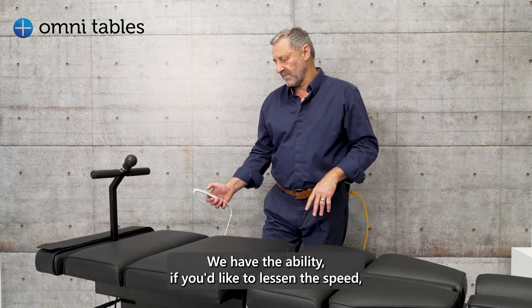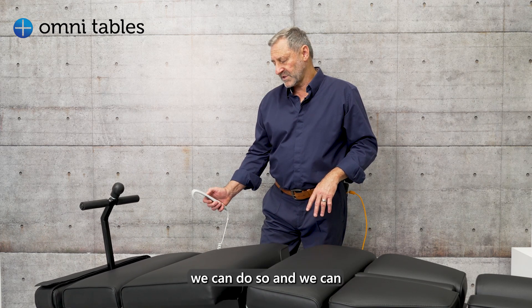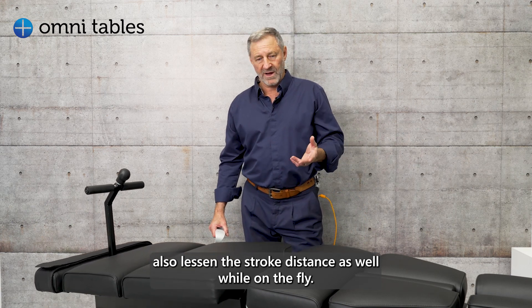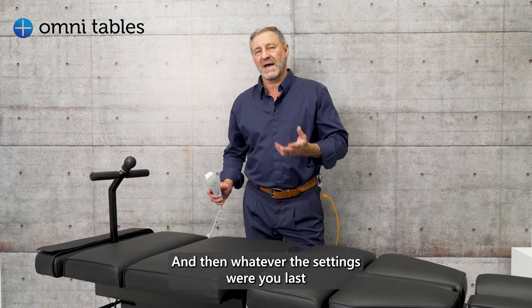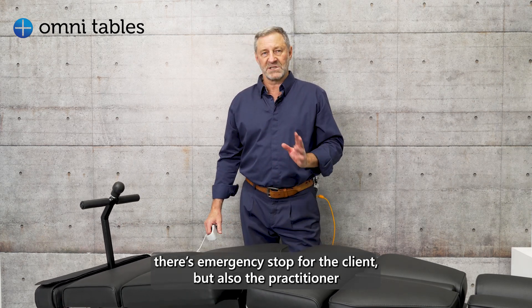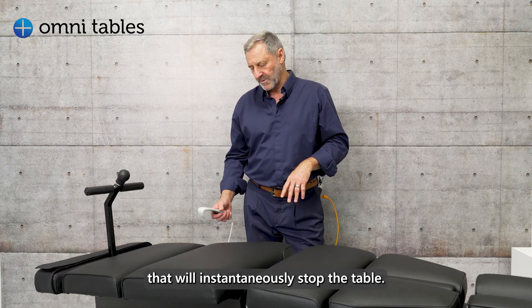On the fly, we have the ability to lessen the speed and also lessen the stroke distance, and whatever settings you last finished with is where the table will start next time you commence. There's also an emergency stop for the client and for the practitioner that will instantaneously stop the table.